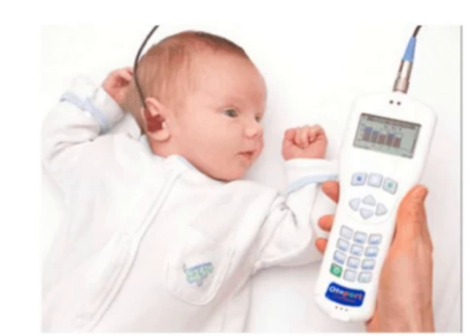This also generates a byproduct lower amplitude wave that travels back along the membrane, through the middle ear, and emerges out the external ear canal as an OAE that can be recorded by a microphone in the ear canal. In humans, the cochlear amplifier allows us to develop sensitive detection and frequency resolution to distinguish the critical nuances of speech. The cochlear amplifier is lost in patients with sensorineural hearing loss, which manifests as poor speech discrimination.